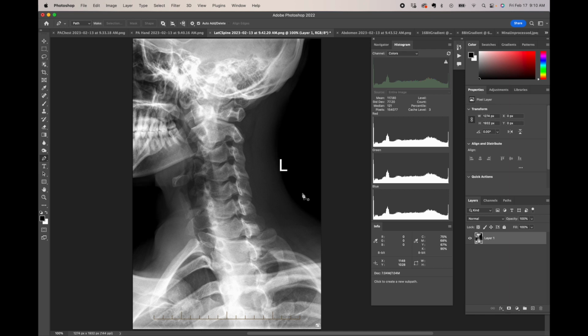And if you're needing detail of that area, you could adjust your images on your monitor based on those numerical values and know that you have detail regardless of whether your monitor is calibrated correctly or not. And monitor calibration is something that I'm going to get into in a minute as well.